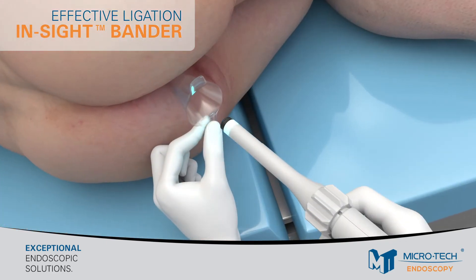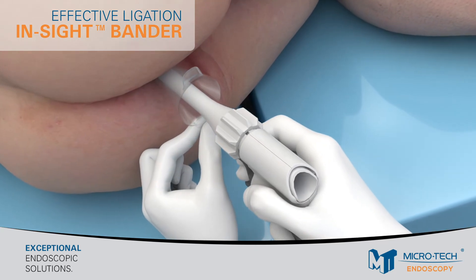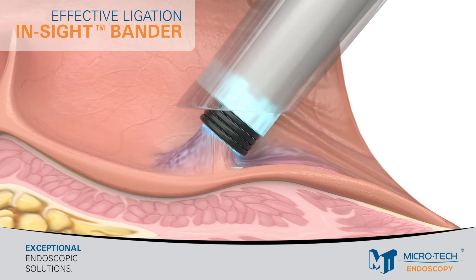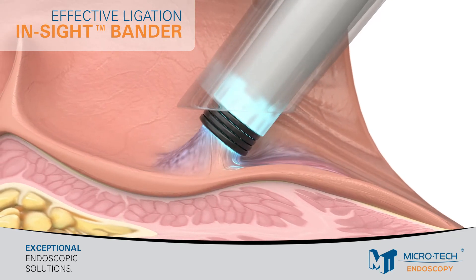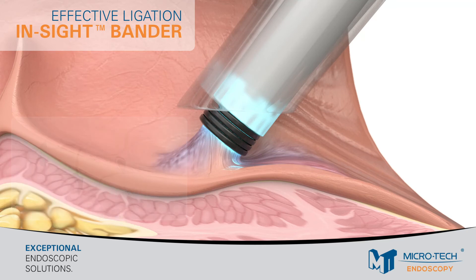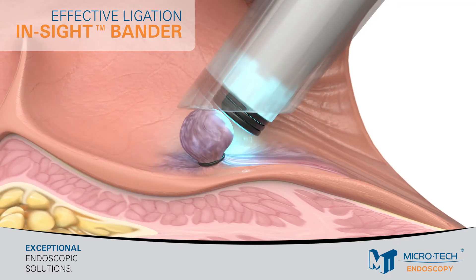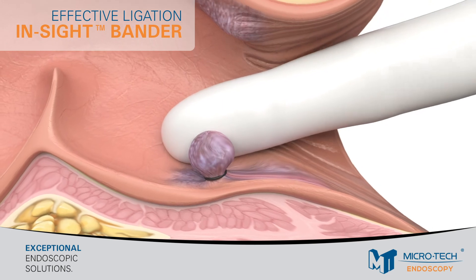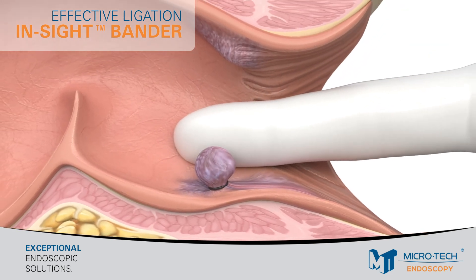Squeeze the trigger to create suction and approximate the tip of the ligator towards the target area, then release the trigger. This will suction the tissue inside the barrel. Turn the outer tube clockwise to release the outermost band. Up to 3 ligations can be performed under one treatment session without removing the anoscope from the patient. Remove the anoscope and perform a rectal examination to confirm proper rubber band placement by palpating the narrow neck of the banded hemorrhoid.